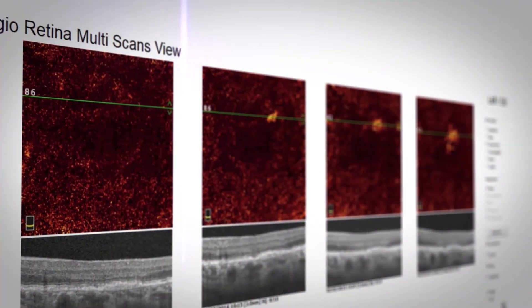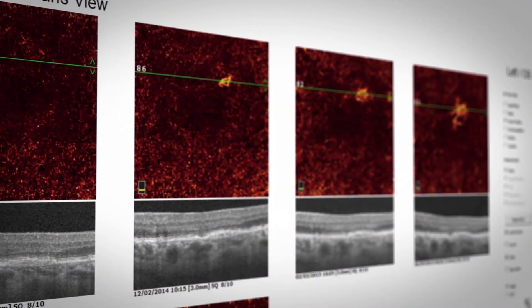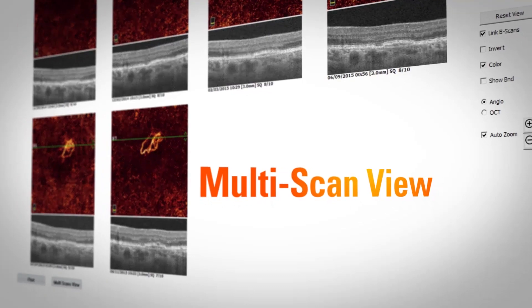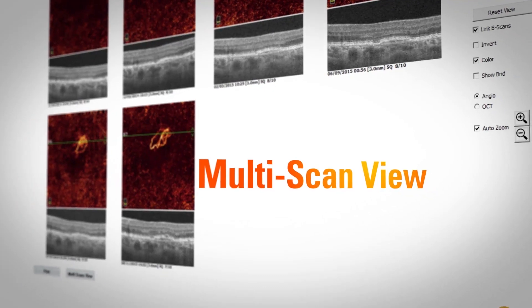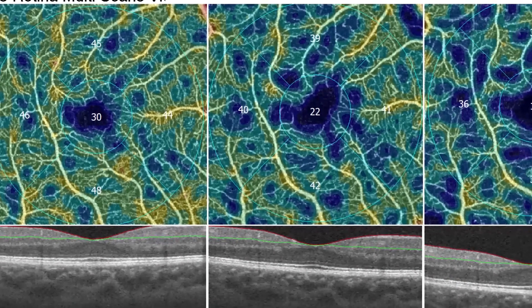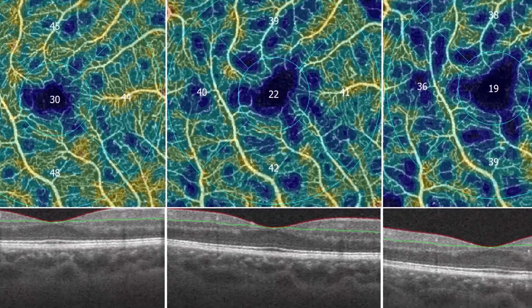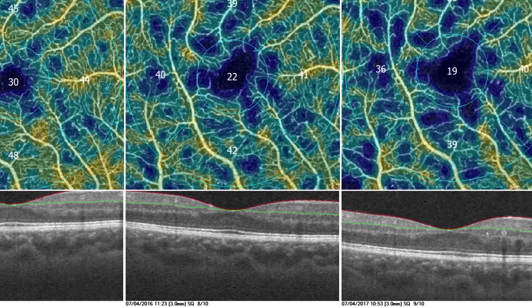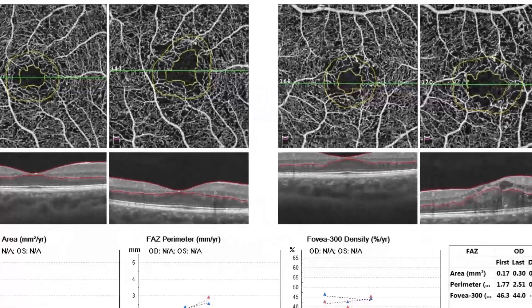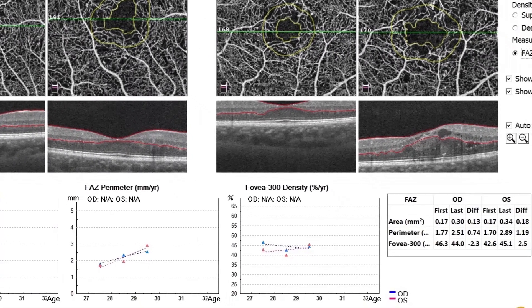Gain new insights into chronic diseases of the retina and optic disc with AngioView's Multi-Scan View and Trend Analysis reports. Multi-Scan View visualizes visit-to-visit change with predefined en face OCT slabs, based on anatomically consistent boundaries across subjects and visits.